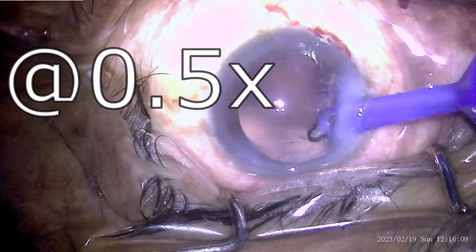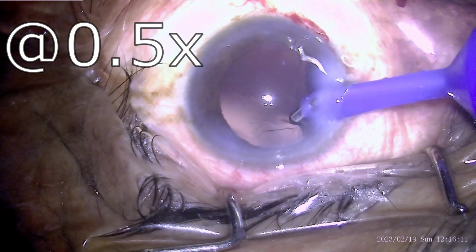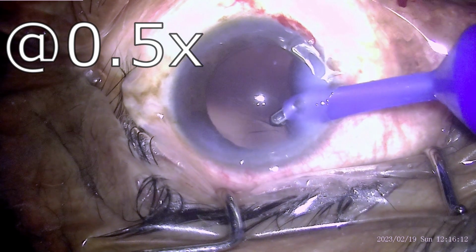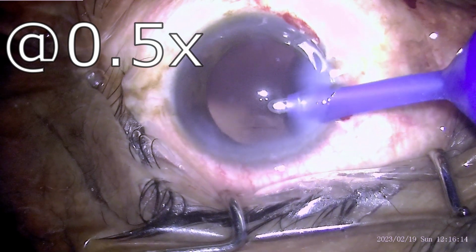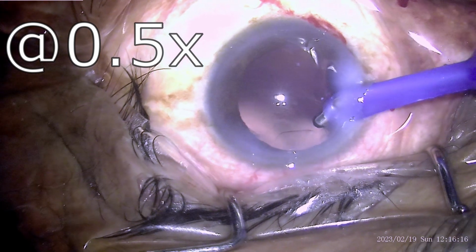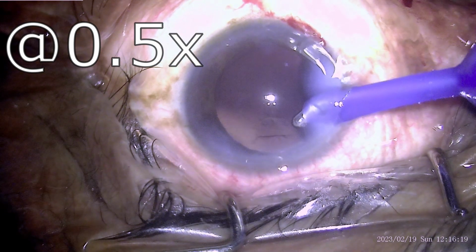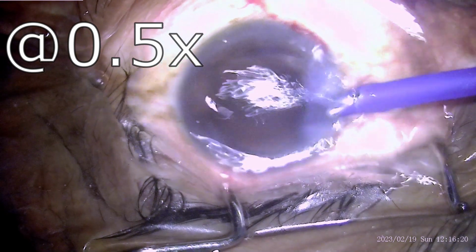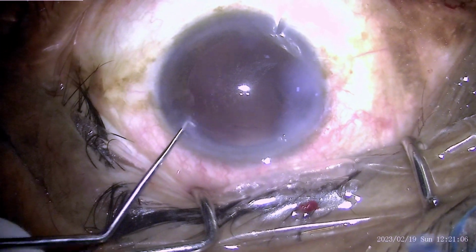So you'll see that again in slow motion, and we can see the shallowing of the anterior chamber because the aspiration port is still inside and working, and the irrigation ports are in the wound which is choked, and so the irrigation is not coming up. So the posterior capsule is elevated and is aspirated in the aspiration port, and this causes a tear, and we can see a strand of vitreous following it.